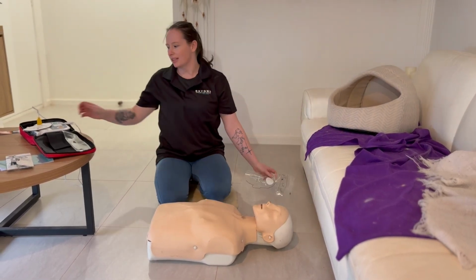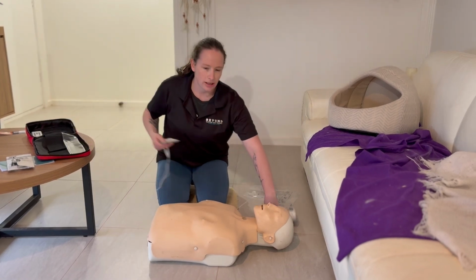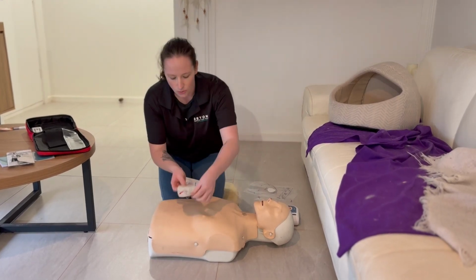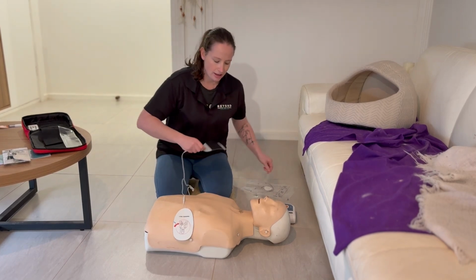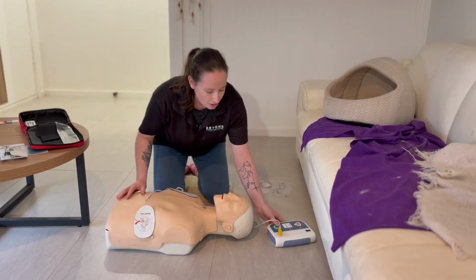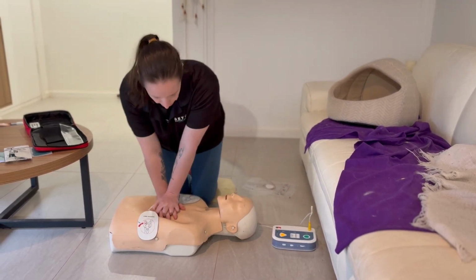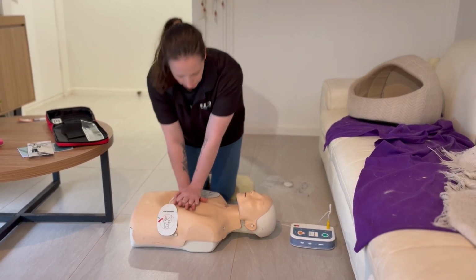If we have an AED, or an AED comes to us, we want to place that on as well. If we have a second person, get them to place the AED on while you're doing CPR, following the pictures. So one underneath the left breast and one on the right shoulder. What you need to watch out for is any pacemakers on the shoulder, or any excessive amount of hair. You'll continue doing CPR until the AED stops you.